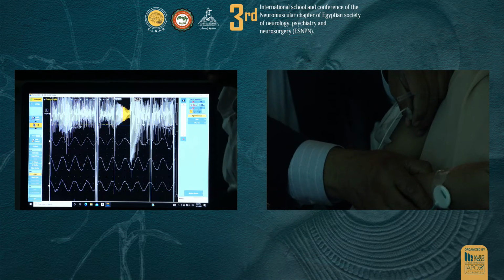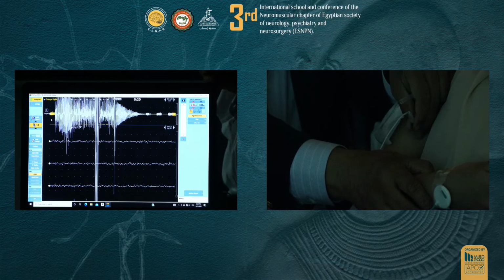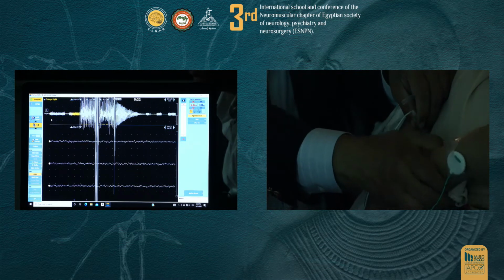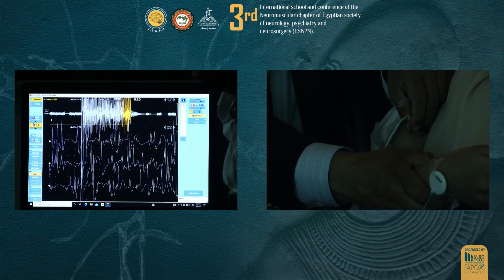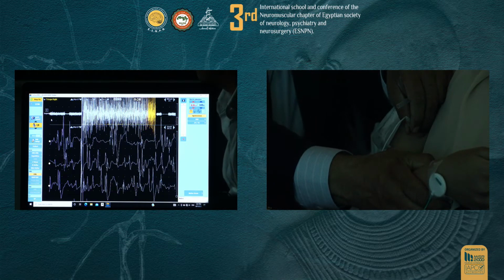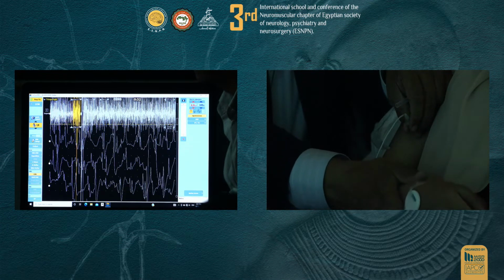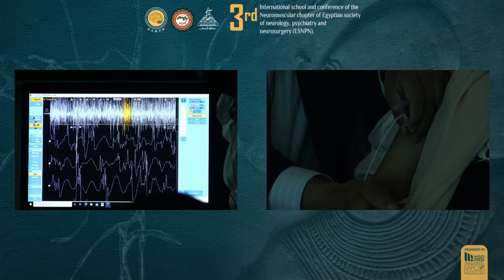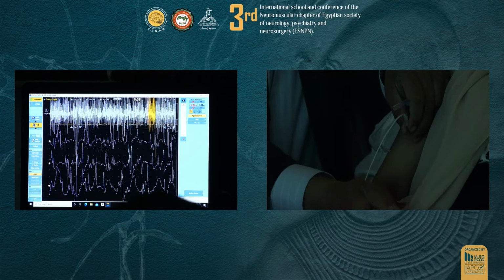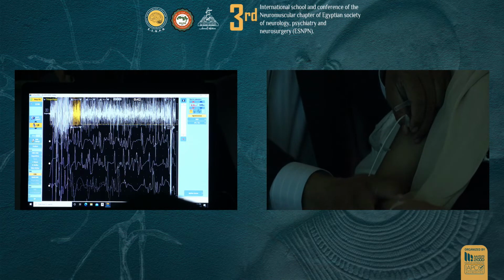So what you hear is a lot of dull thud sounds. Make a muscle. So she definitely has got early recruitment. I can't recruit a single motor unit. Okay, she recruits a lot of motor units with a little effort, so she looks like having early recruitment already in that at mid.